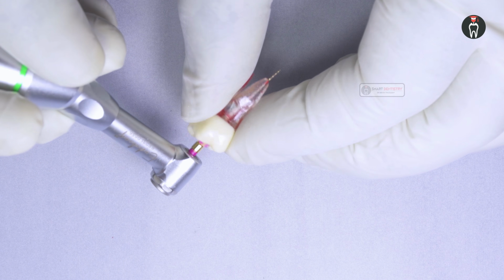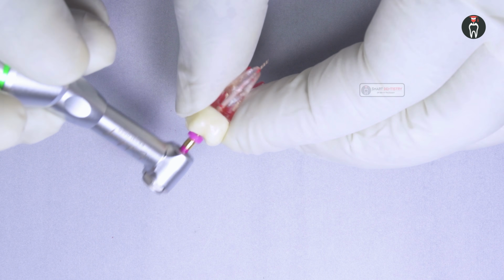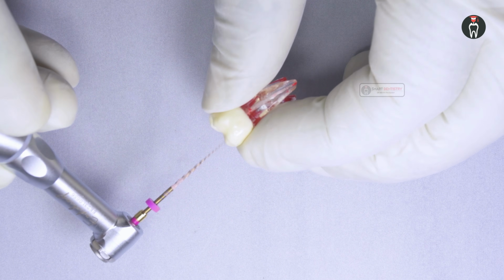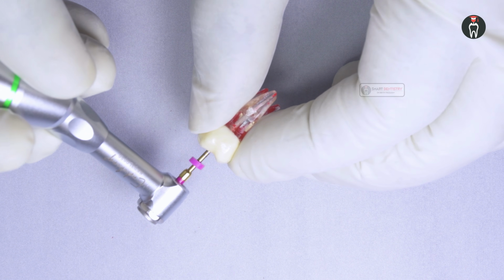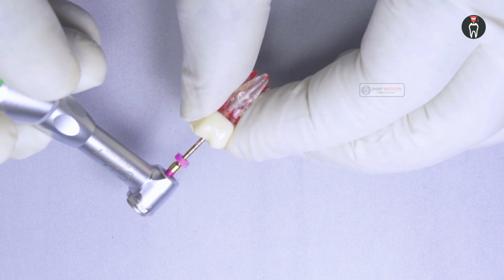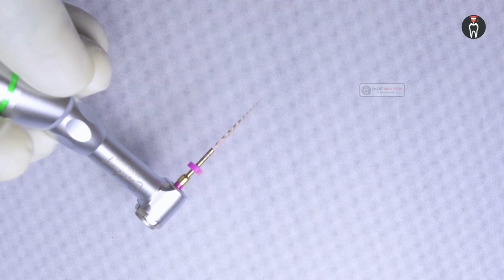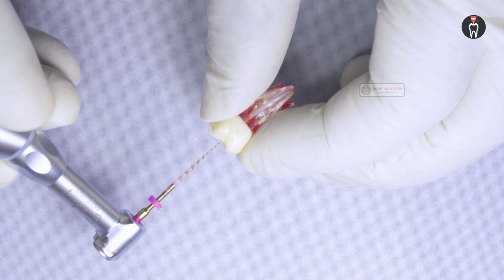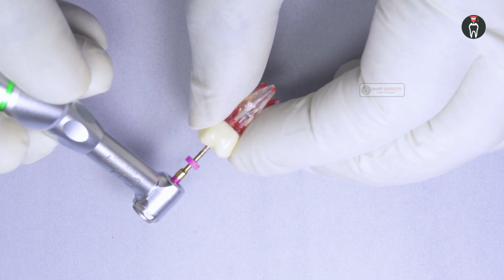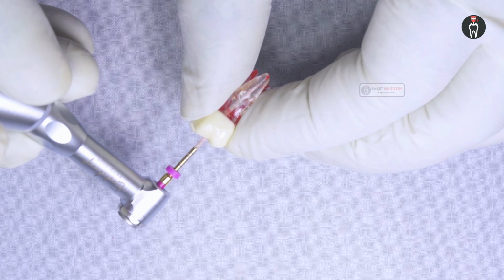I do not recommend going to a speed more than 300 rotations per minute, but there are certain files which are recommended to be used at 500 or 600. In those situations, we have to keep the torque to be a very minimal level. And for example, if you are keeping a torque at 3 and if you are setting a speed at 600, then we can expect a higher screw-in effect with this higher speed.